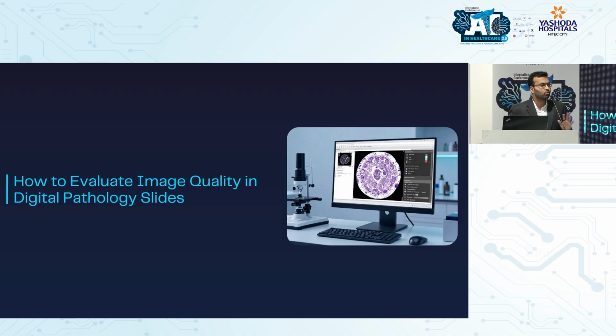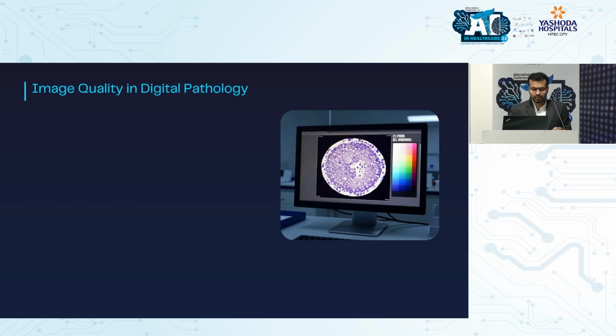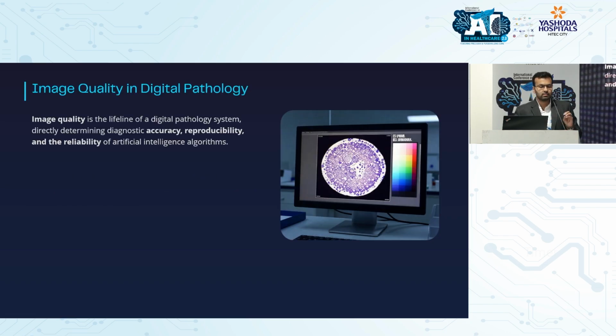So I'm just going to present 2 or 3 of those here, which you can ask your vendors, so that your comparison has to be objective. It can't just be subjective. One person's ideal quality may not be another person's ideal quality, right? So image quality basically is the fundamental aspect of any scanner. It will determine your diagnostic accuracy, reproducibility, and reliability of your various AI algorithms. We'll focus on 2 aspects of this. One is called image resolution, and the other one is color fidelity.